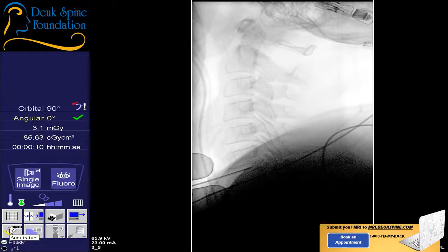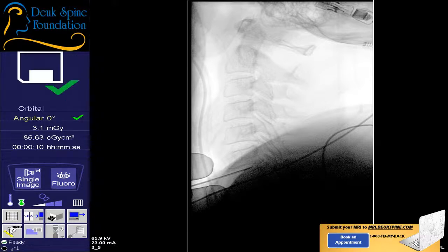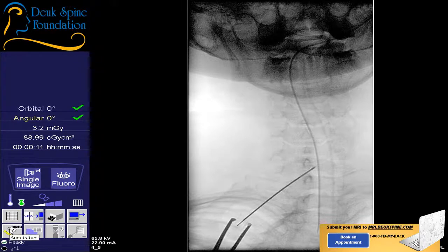All right. I got to release my fingers, which are killing me, but that's the hard part about the surgery physically for the surgeon: holding down on the neck properly so you can get the needle in position. All right, so that's our lateral there. Wait, stay there. 2, 3, 4, 5, 6, 7. Yeah, go ahead and do a quick AP. So the nice thing is she has a perfect neck for the surgery. On a scale of 1 to 10, she's a 10. All right, that's perfect. Just stay there.